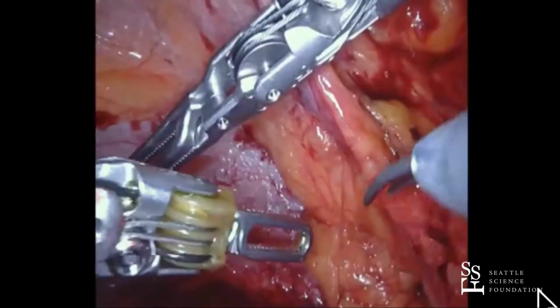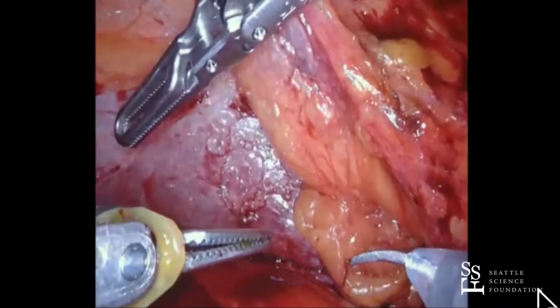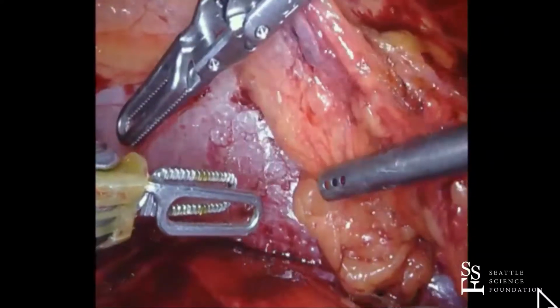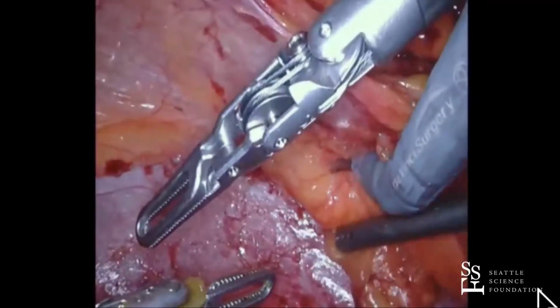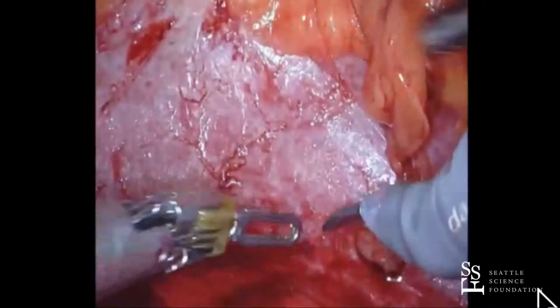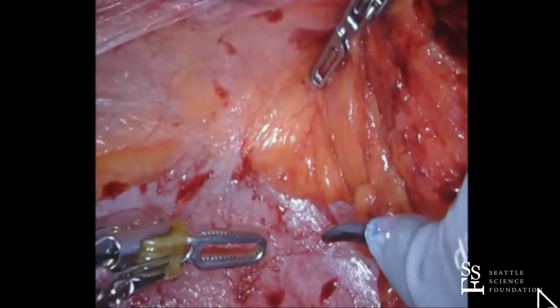That point about the second black line on the ports, I was going to say, even for the trans cases, I rarely will go all the way to the second black line, just to create more space. So I don't pay attention to that at all. There was a question about the fulcrum of the port being that second black line, and how relevant that is. In general, we stopped paying attention to that.